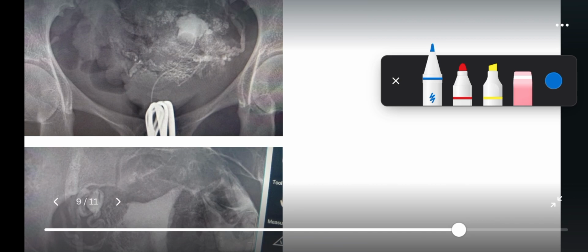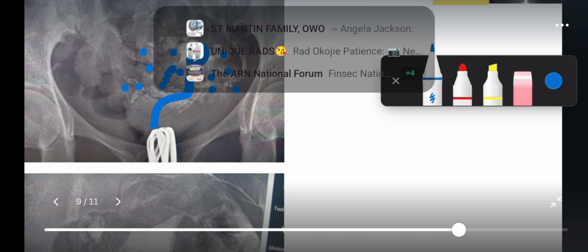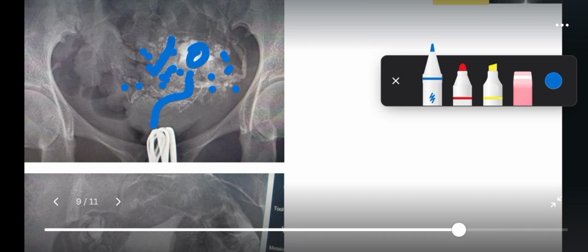This is a case of intravasation. We see they use a catheter for this case. You see this tiny line is the catheter. Then this is the womb. But then we see so many things outside here. These are the dye entering the blood vessels. This could be a case of doing HSG when the uterine cavity, the inside of the womb, has not recovered to some good extent. It may have been done closer to the menstrual flow.